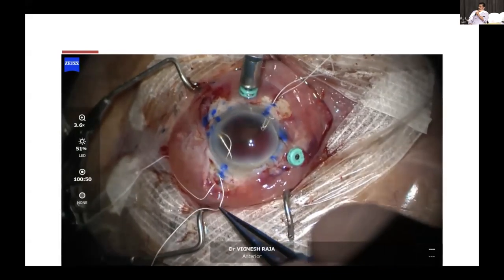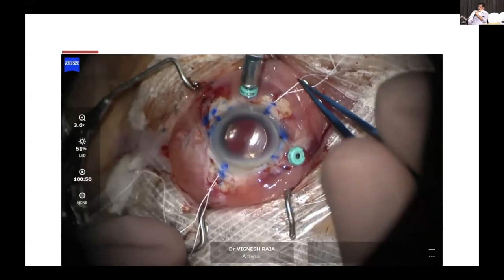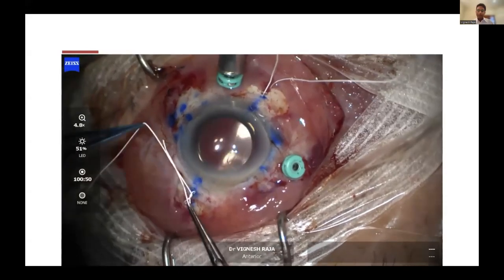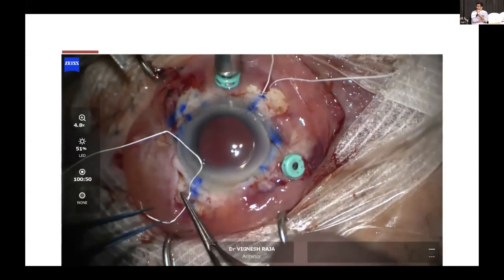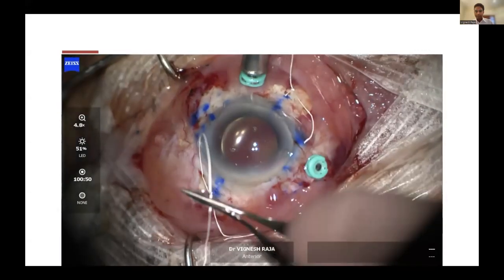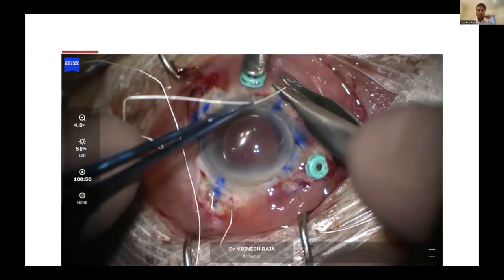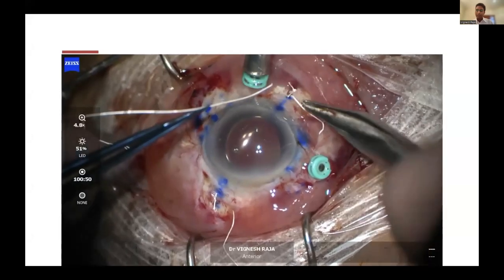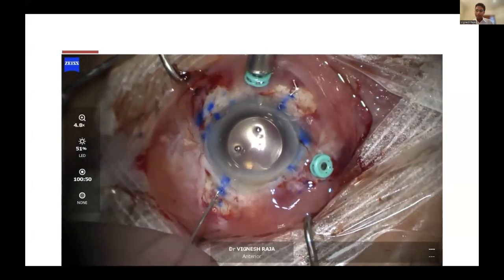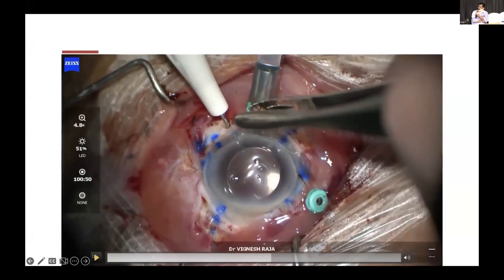So now you have passed these two through the 1.5 and the 3 millimeter sclerotomies which you have created. Correct. And I pass it through the eyelet on the Envista lens, and I'm just suturing it using a sliding slip knot. So this is a good case to implant a toric lens, when we have to scleral fixate a toric lens. This knot goes in through the 25 gauge very nicely.